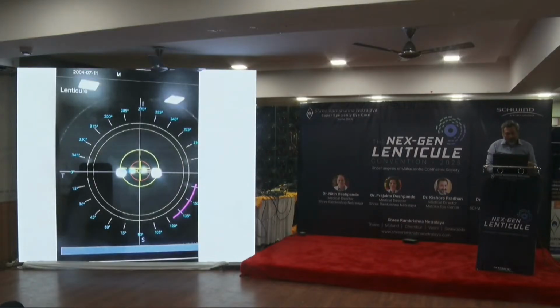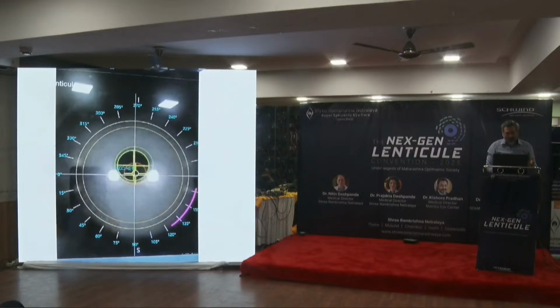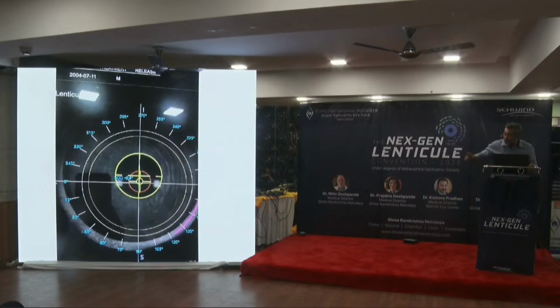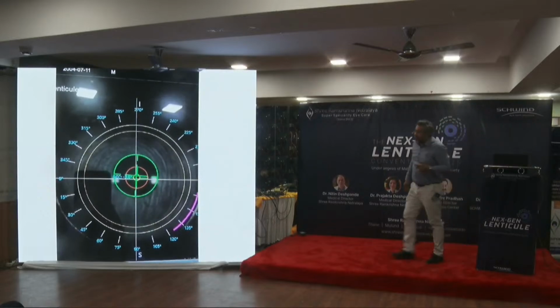I think these videos are already present before. What you have to understand over here, what you need to see, is the cyclotorsion can also be displayed right on the screen, the amount of cyclotorsion. You can already see it's measuring.